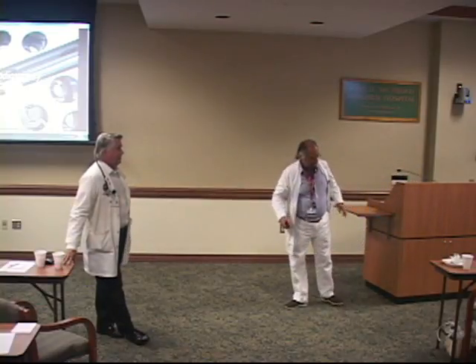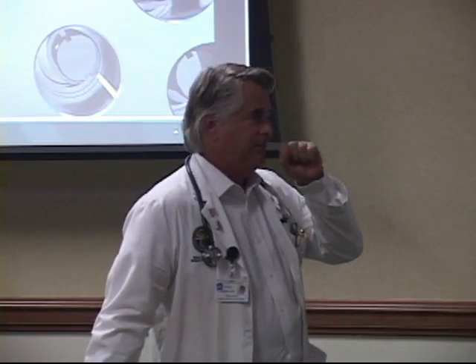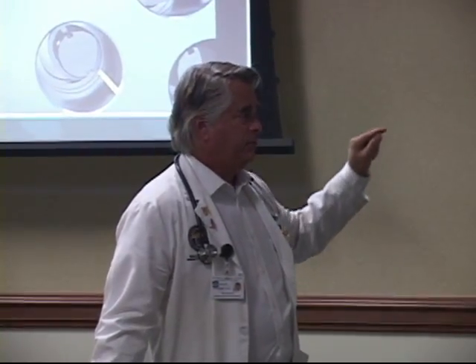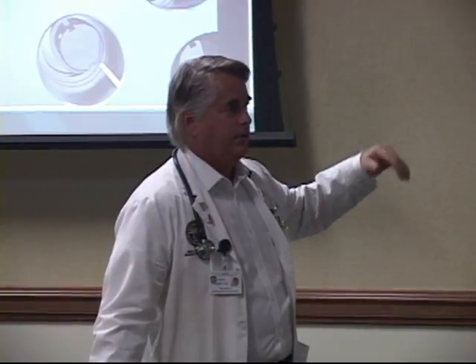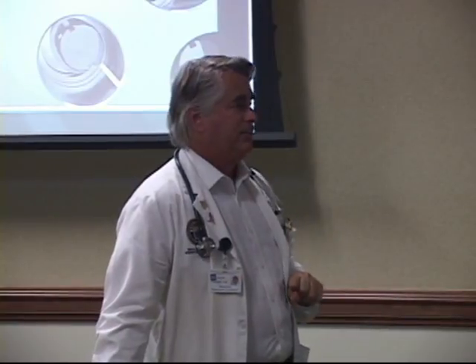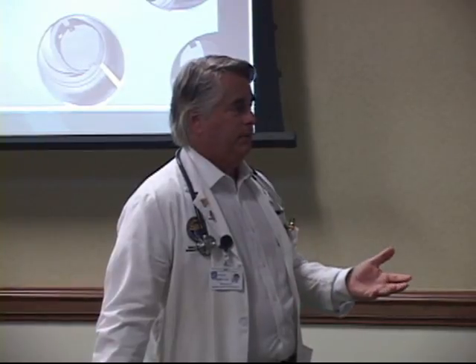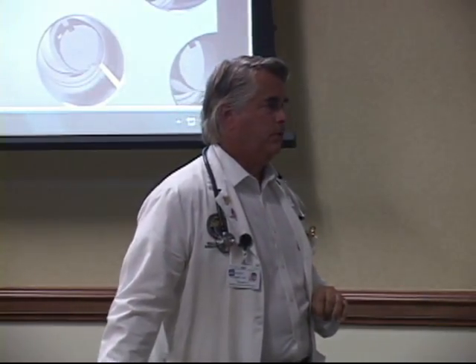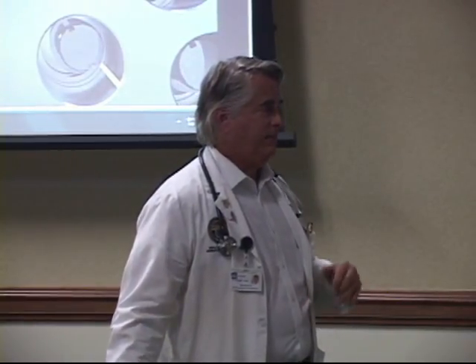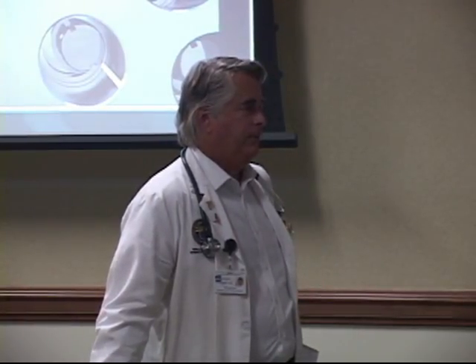Like 3 or 4. Here, he would definitely get Gamma Knife. For melanoma, it's actually really good for that because melanoma tends to be pretty resistant to standard doses. So these are very high doses, so you can overcome the shoulder on the curve, is what we call it, and you get into the dose that'll actually kill a tumor. But he's also got it in his liver, evidently. Now there's some new immunodrugs, some monoclonal antibodies that are actually working well with melanoma. So it could be that if he got Gamma Knife and some of these newer drugs, he could live a long time. If he gets lucky.